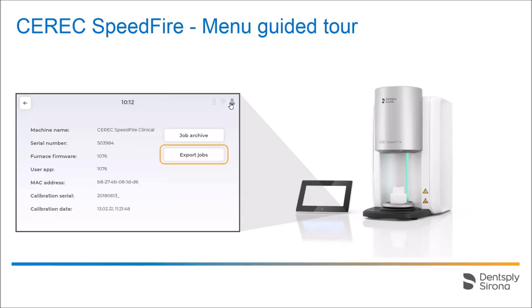By tapping the export jobs icon, jobs can be transferred to a storage medium. The job archive includes new orders and those with errors as well as completed ones. Here you have the option of permanently deleting orders or, if possible, transferring them back to the list of orders. Next, we will take a look at some options.